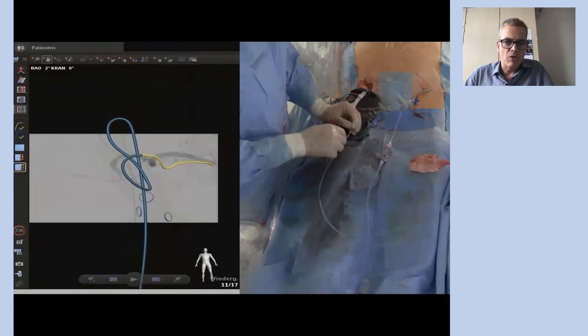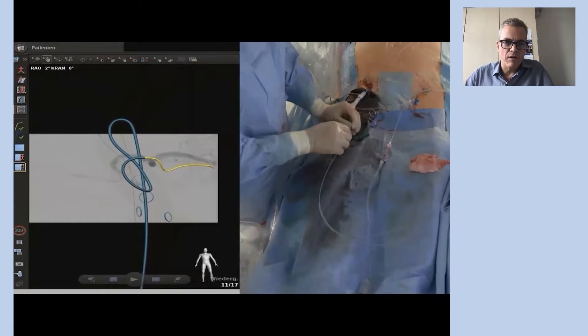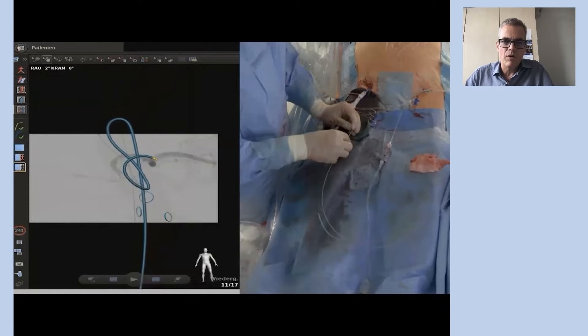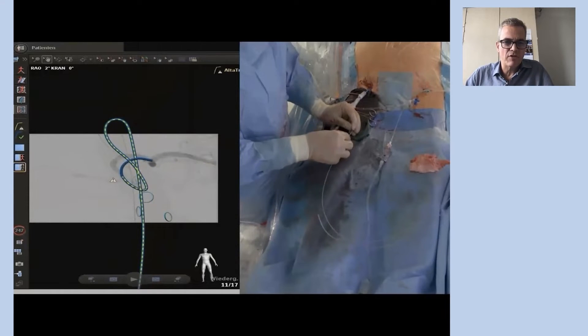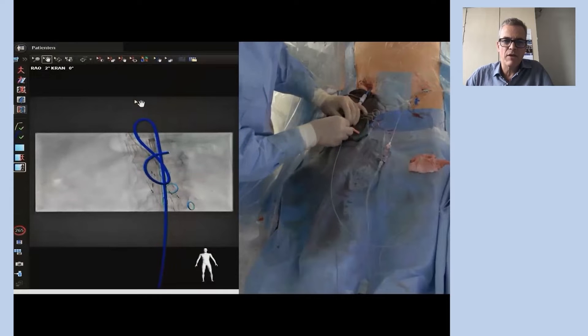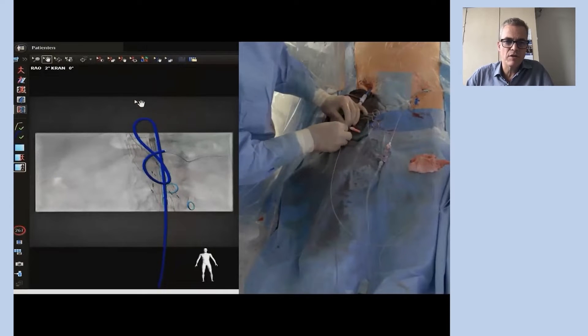This is already the final part of the celiac artery, and you see how well the 3D visualization helps in understanding the 3D anatomy of the patient.